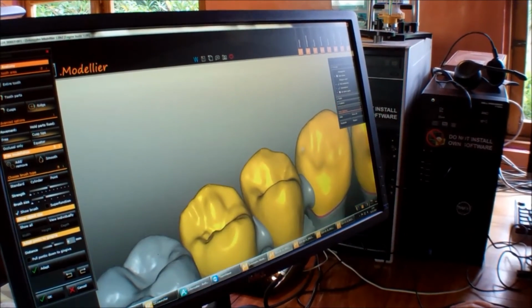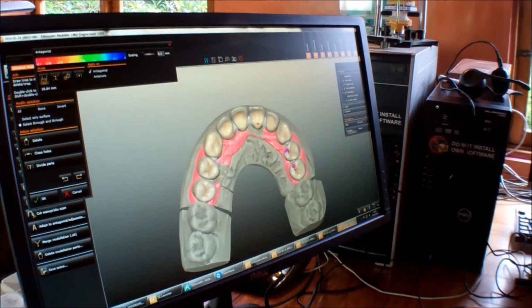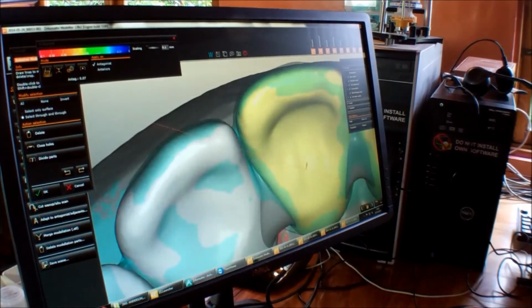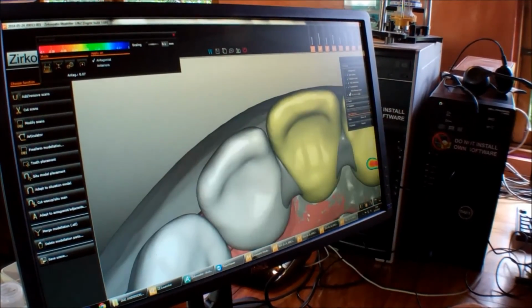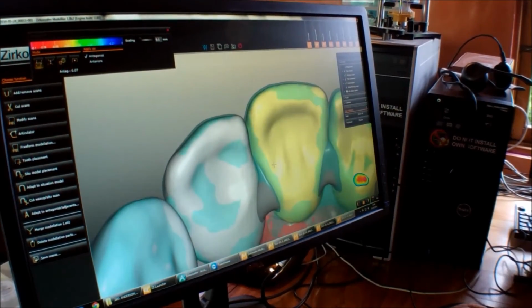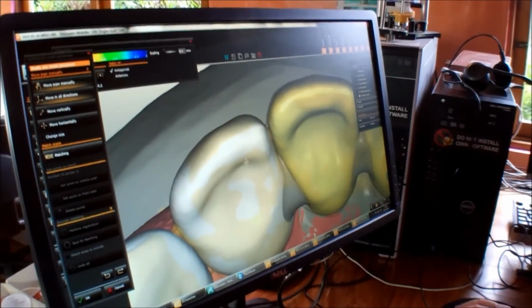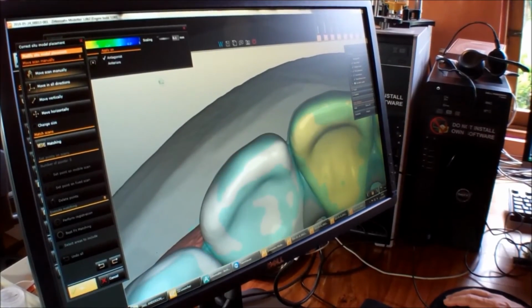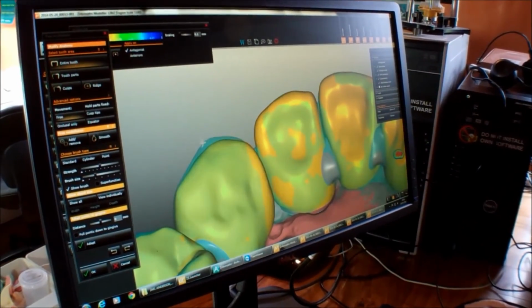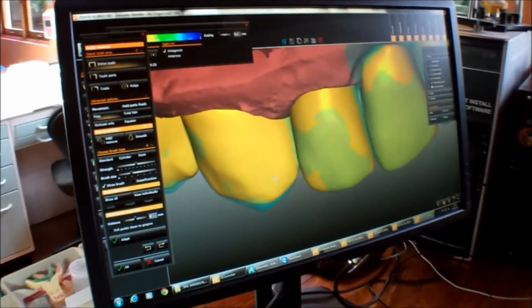So we reproduce it. If I show you, this is your situation. The blue one is the situation that you have in the mouth. You see? But then, when we touch this, for example, the yellow is what we have. This is the change that we did. You see that the cusp touched. Yeah. This is what we did.